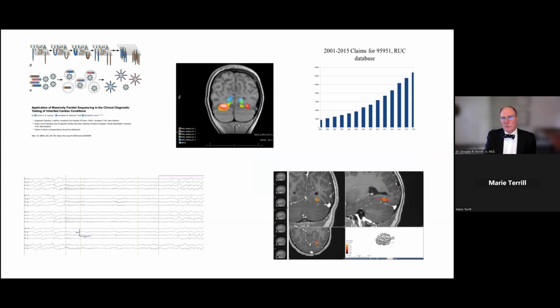Sometimes it's MR information, in this case, functional MRI data for visual activation. And sometimes it's stereo EEG implantation with the derived information from that and next generation sequencing over in here. So in the midst of our very busy days with all these other things going on, we somehow have to synthesize this information for the good of our patients.